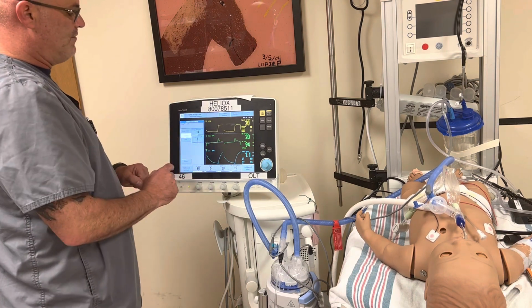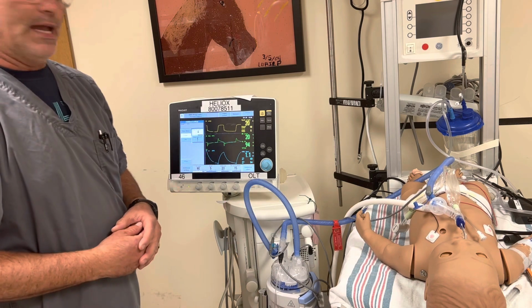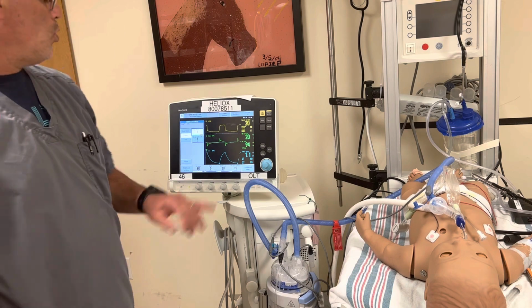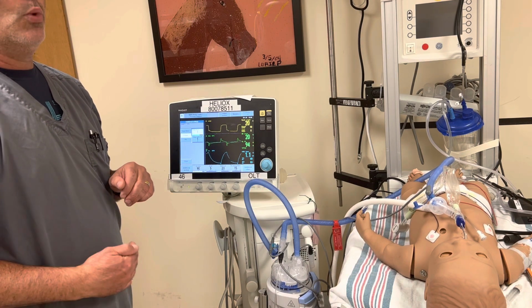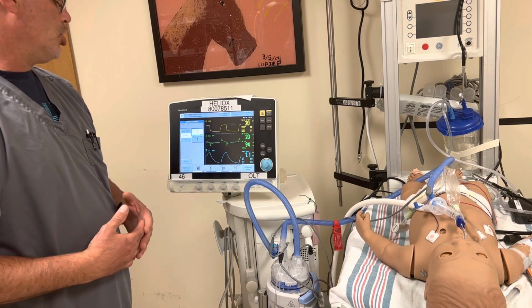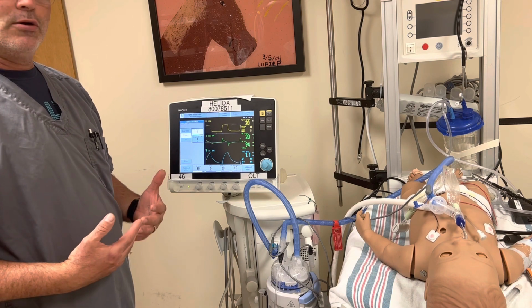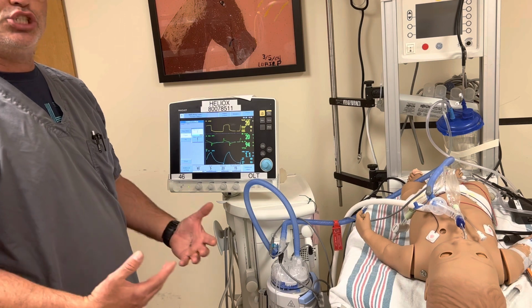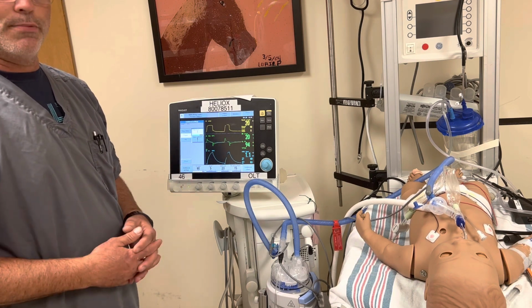The next thing we have to set is our trigger of the vent. Our policy says that unless otherwise ordered, we're going to set that trigger to be as sensitive as possible without auto-triggering occurring. Now, auto-triggering occurs when the ventilator perceives flow dips or flow decreases and thinks that it's the patient actually trying to initiate a breath, and thus gives them a pressure support breath or an additional breath.